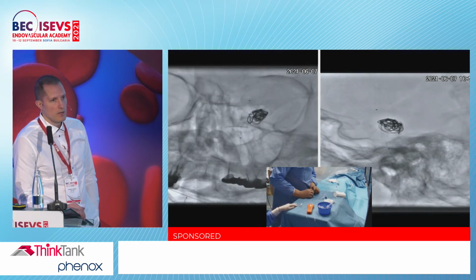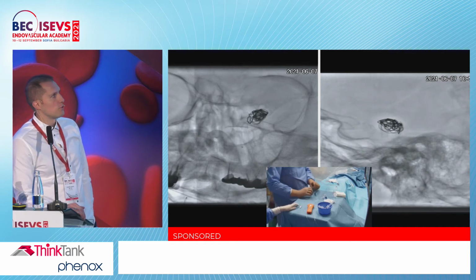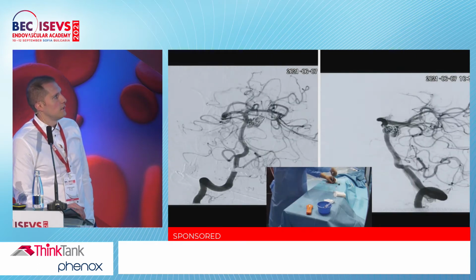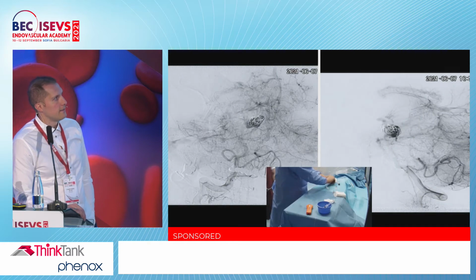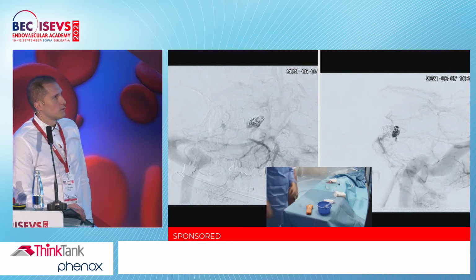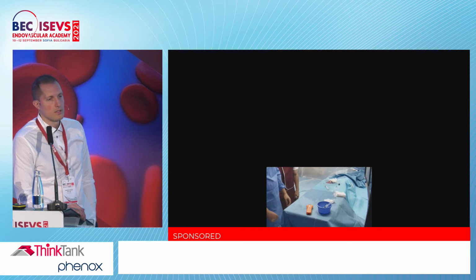This is the removal of the wire of the stent. I didn't want to go through the stent here because I like the positioning against the wall. I didn't want to change anything in the structure of the stent. And this is the final result, with, as I said, very good stagnation of contrast with the coil. So it was one of our first cases in which we introduced the stent with the HPC coating in an acute phase. So thank you for that.